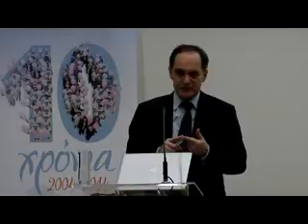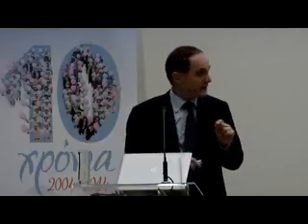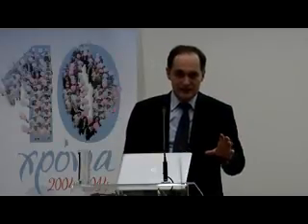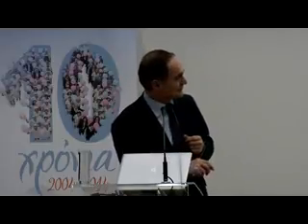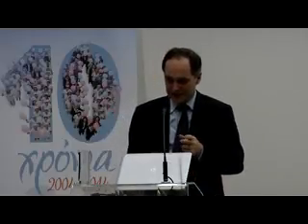And there are only 2 differences between the groups. One is that in this group, still dysmorphic T-shaped uteri were present. In our group, none. All natural T uteri. And the second is that they use the resectoscope, big instruments, and electrical current, and we the small hysteroscope and only the scissors. And the group in Valencia, who is using the same technique as we do, have 115 now, and they have just the same results as we have. So I think that the surgical technique will probably be the most important one.